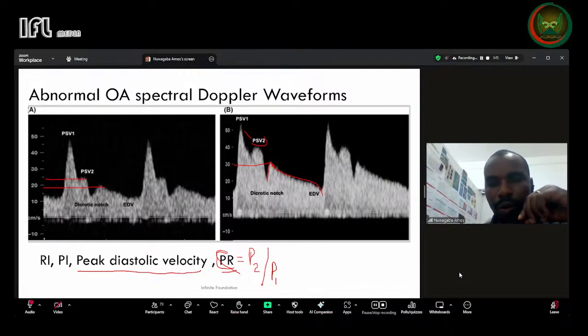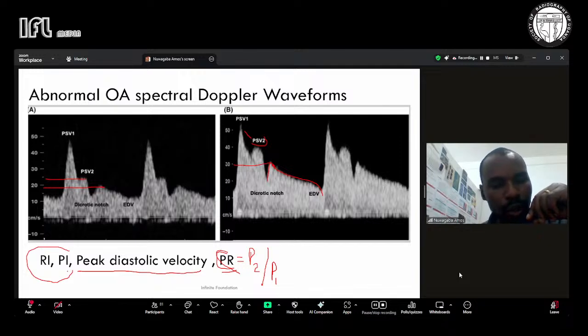And of course, we know that eventually this causes cerebral edema, and preeclampsia can progress into very severe features of cerebral hyperperfusion. So RI and PI are usually also abnormally low. Usually they should be low, but of course you have to be very careful and see when the PI and RI are abnormally low because of hyperperfusion.